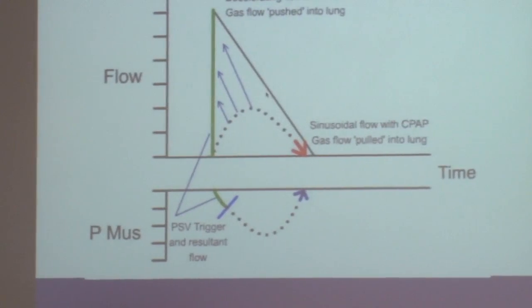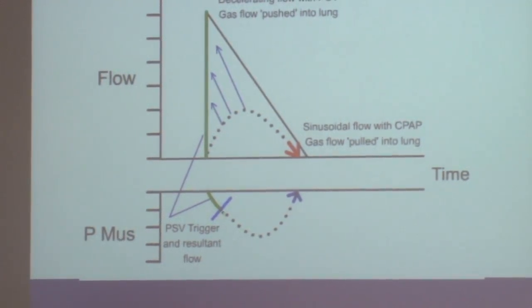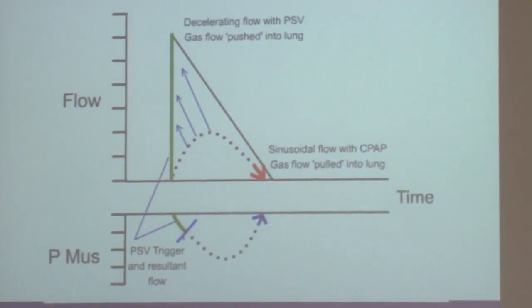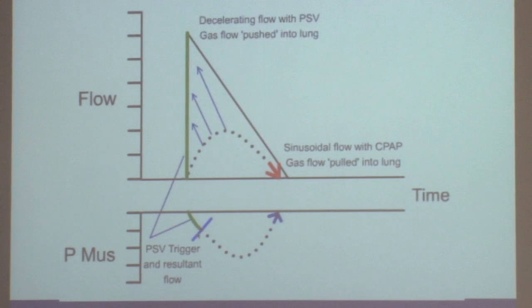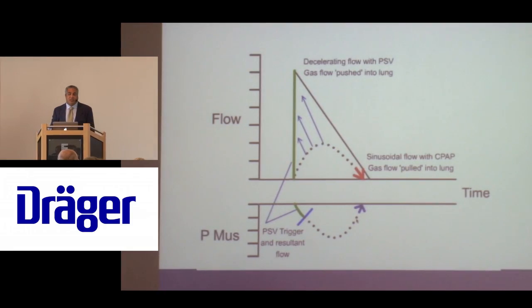And again, if you look at, let's just use pressure support as an example, the patient just merely needs to trigger. And now the trigger is essentially telling the machine how to react. It has no proportionality, it has no concern for the time course of that effort. And of course, as we inflate our lungs, and our lungs get bigger, we naturally decay our ability to pull more air into the lung. You can see here, the power is going to go substantially down.